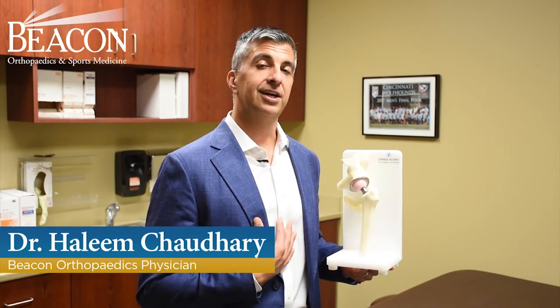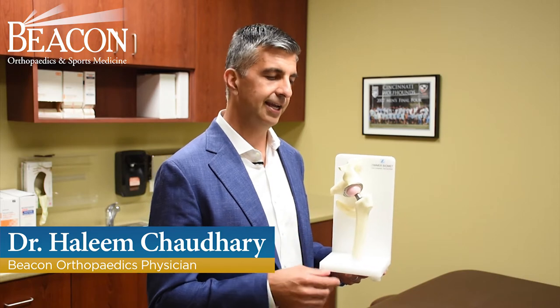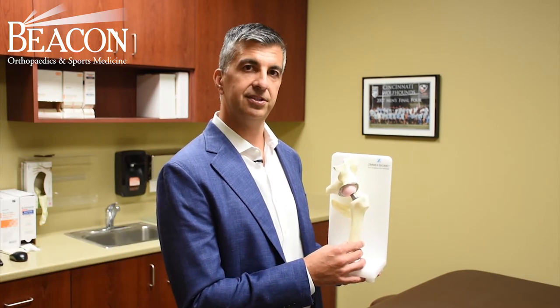Hi, my name is Dr. Hal Chaudhry, hip and knee replacement specialist here at Beacon Orthopedics, and I would like to go over a hip replacement model and explain some of the details about it.